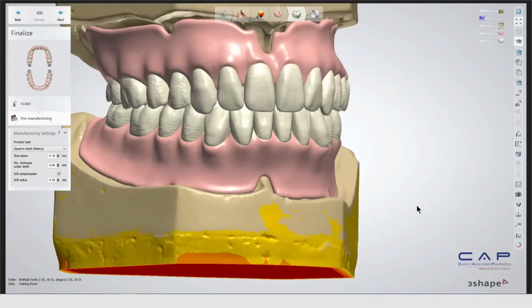Are we milling the teeth or using card teeth from the matching company you choose? In 3Shape, we just go ahead and mill the physical teeth after they're cemented in, as I had described. I think you might mean, are you milling the teeth from scratch? In that case, no, we'd be taking the denture teeth and putting them in there and then milling out the bottom of the denture. And it mills the tooth at the same time.